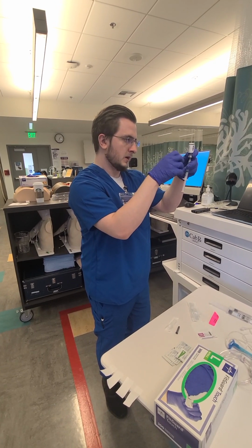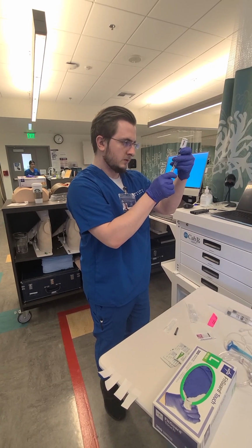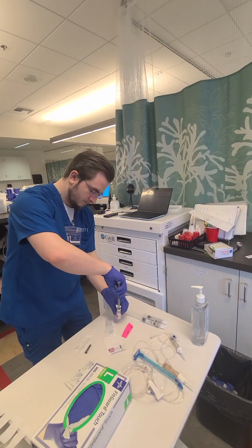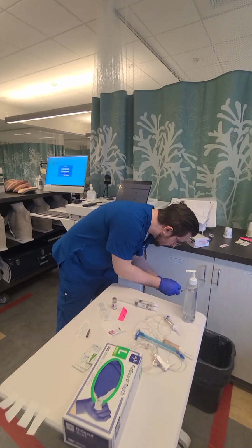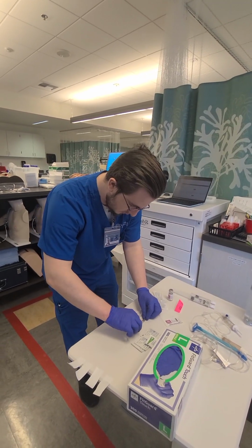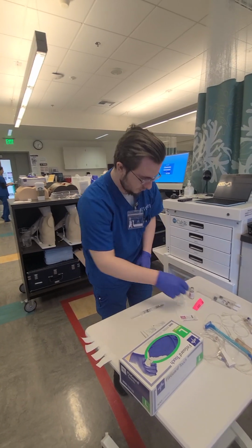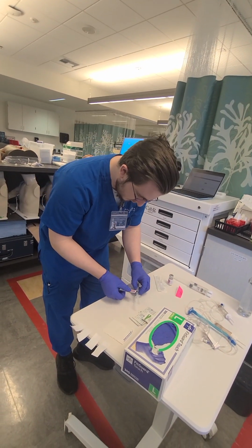Almost. A little bit extra. Make sure I have my 2 mils. Recap my needle. Actually, I'm not going to recap. And then I'm also going to make sure to put the label on it. Make sure that the barcode is visible.